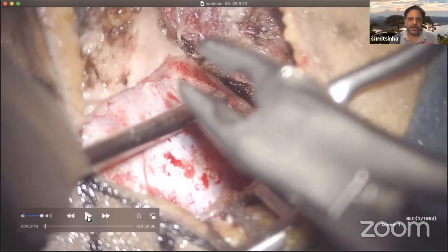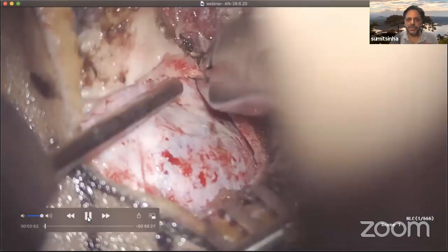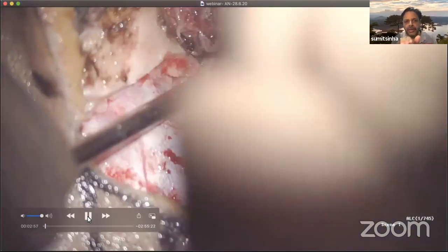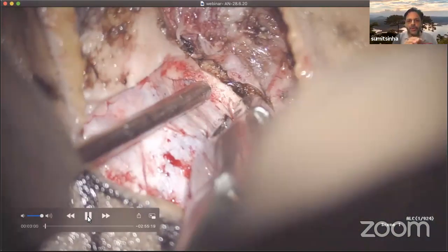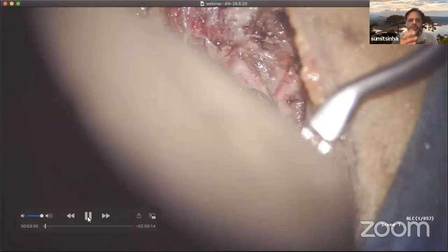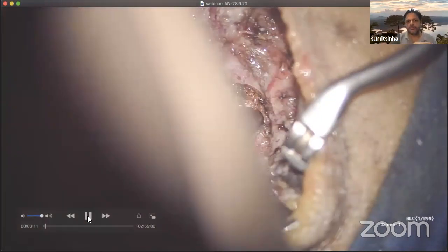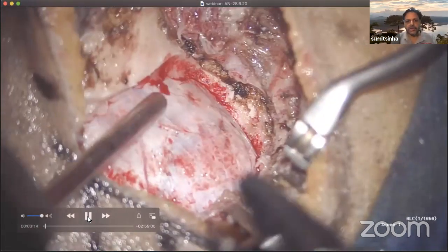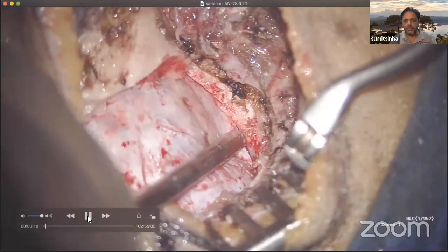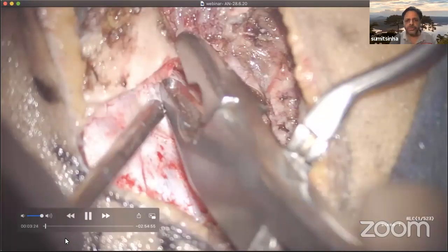Okay. So when you make a craniotomy, then you have to do some cheating business. I always call it cheating, because you have made a small bone flap, and then you have to increase the angle of your viewing. Now, this angle of viewing is very, very important, especially in some surgeries, especially in medial sphenoid wing meningiomas. When you bevel the bone, your angle of vision increases manifold. Even a 20 degree increase in the angle of vision helps you in achieving your target so meticulously. So this is what I am doing right now.